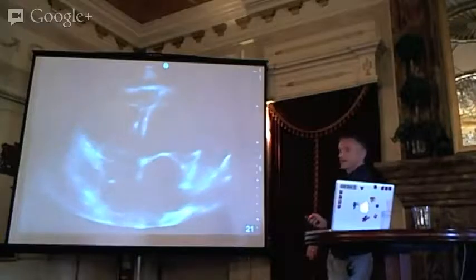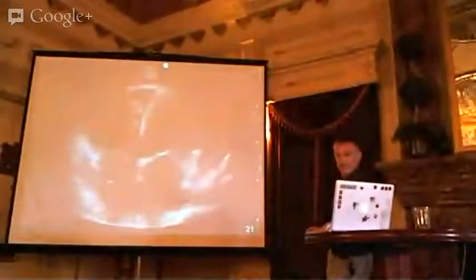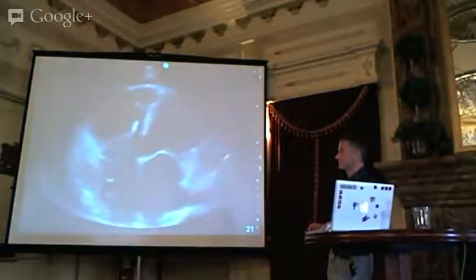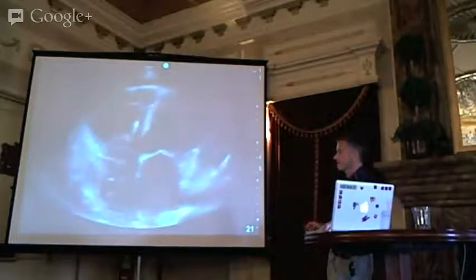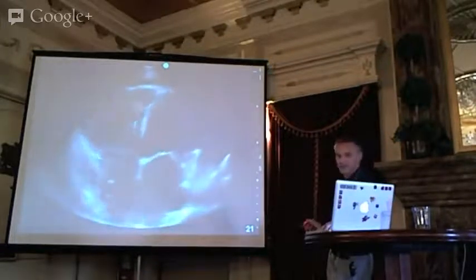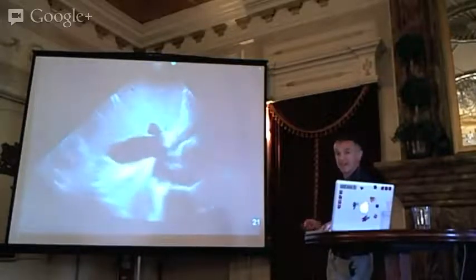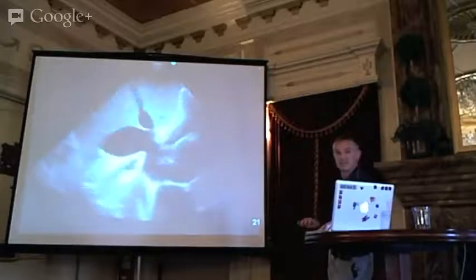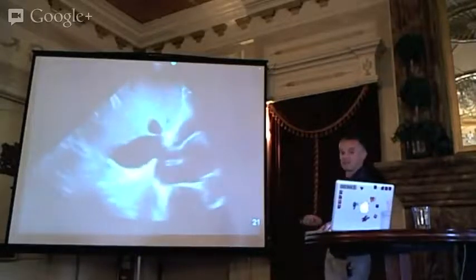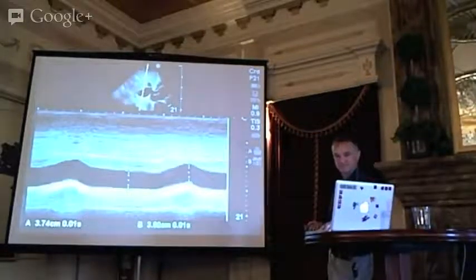There's a weird line there. It's blue. It's blue. All right, so it's a pacing wire in the right ventricle. Got these large, thin chambers that aren't doing much. So these two have got a cardiomyopathy. That's what we'd expect for his pump failure and for obstructive shock. So here it's not helpful. So this is a reminder. And it's massive and not collapsing.